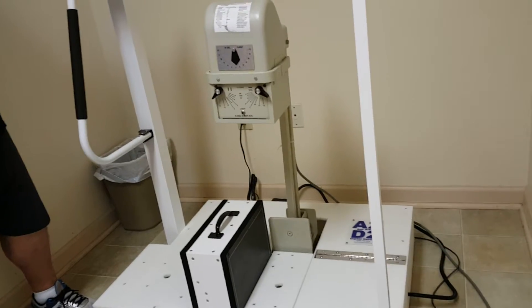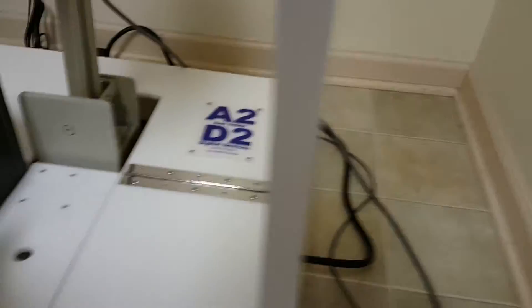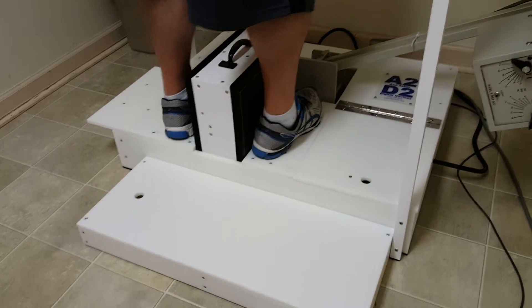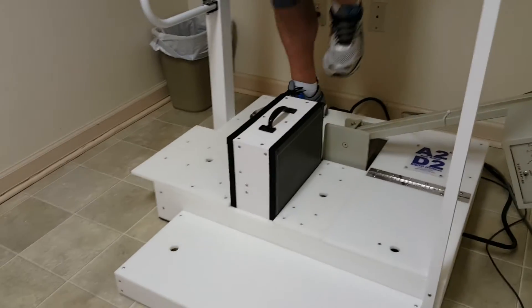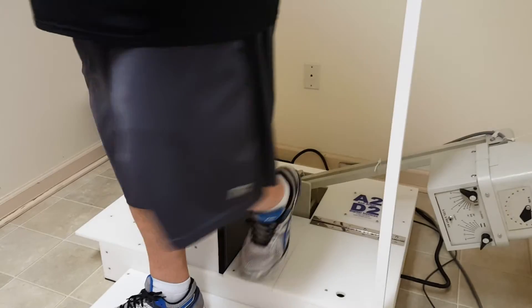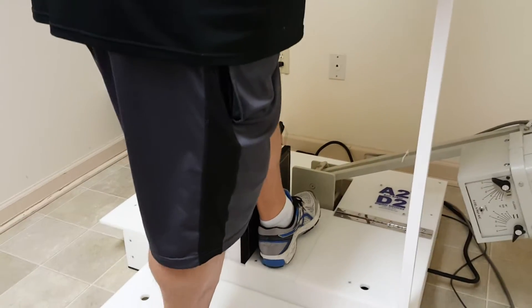Do the left and the right lateral on that same carbon fiber side. We do a right lateral for patients who are nimble enough — they have to turn around. You go left lateral for those patients who are not nimble or you're worried about their ability to make that move. Most practices will do something like this.